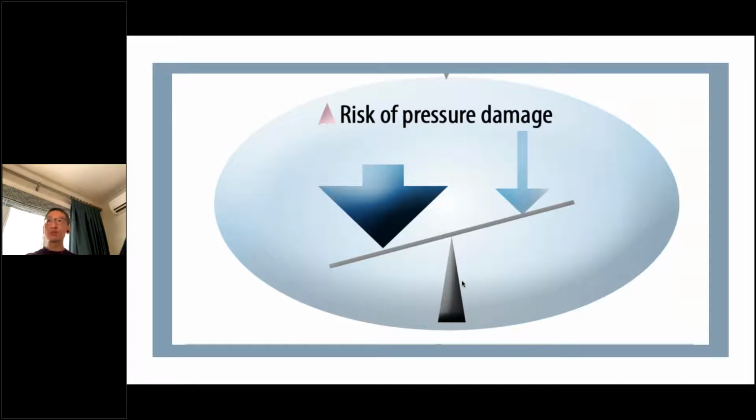Just a reminder not to put too many layers of material. The more layers you have, the more likely you're going to facilitate the accumulation of heat. And there's a lot of new literature using different types of textiles to allow the heat to be dissipated and removed more easily.